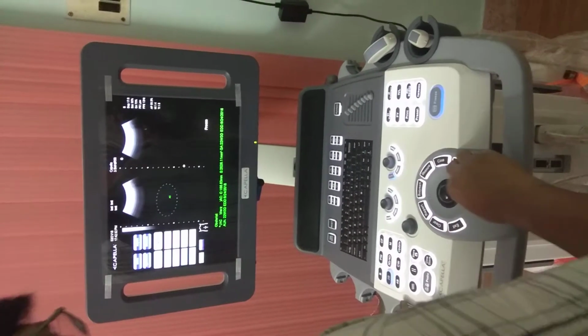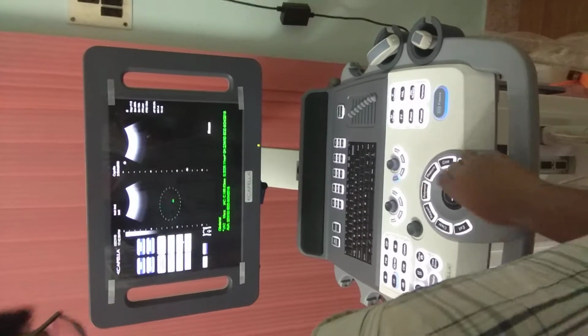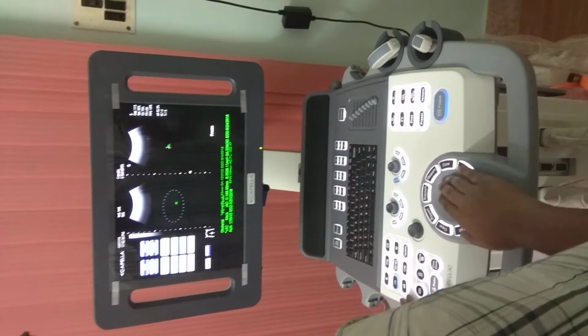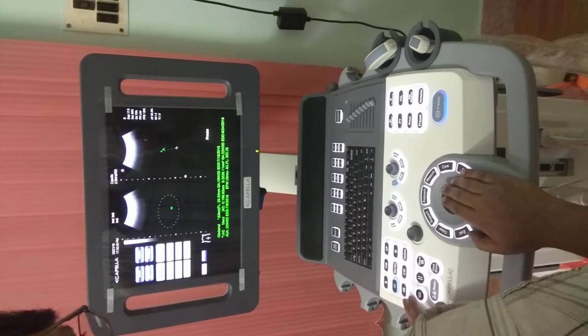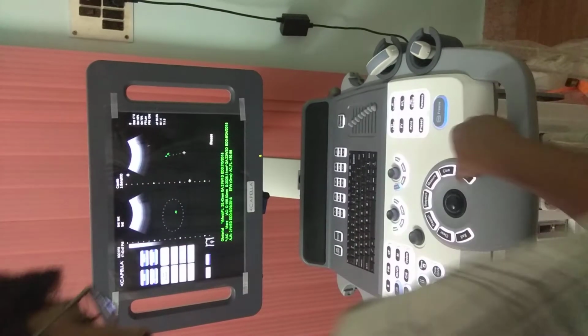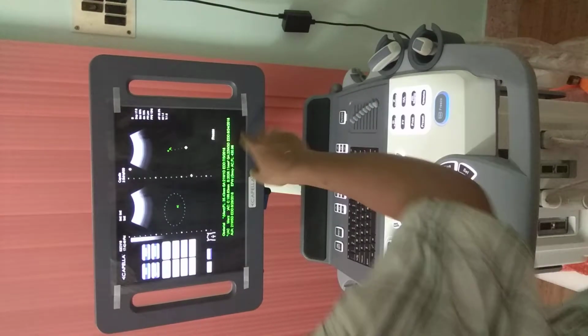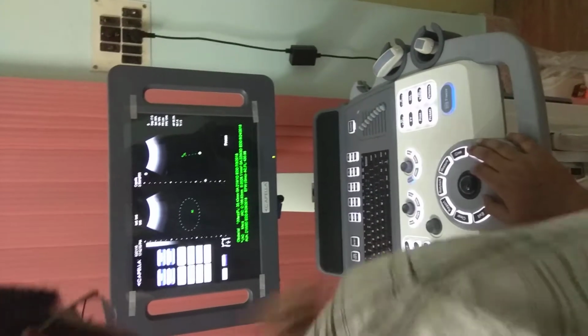And then we have femoral length in long bones. There are different kinds of bones here, so we just select femoral, and we select the femoral length somewhere close by. So this is it, we confirm it, and we can see the fetus weight and everything coming up.